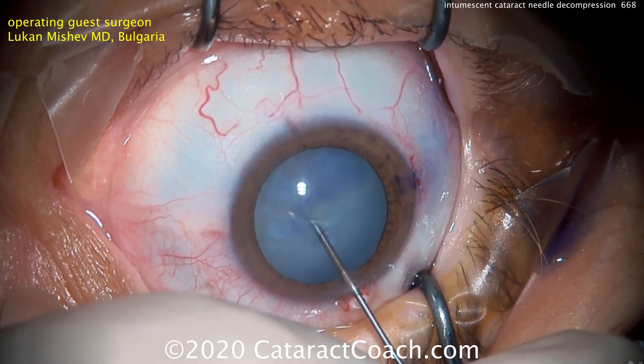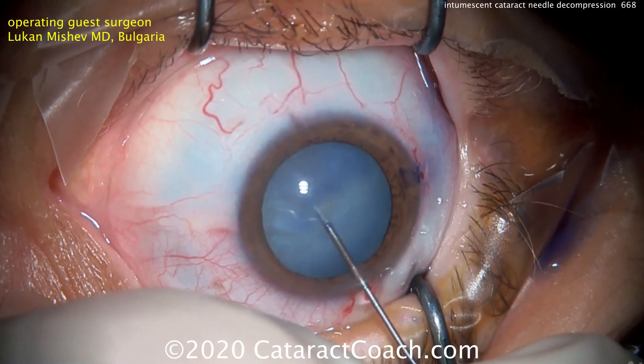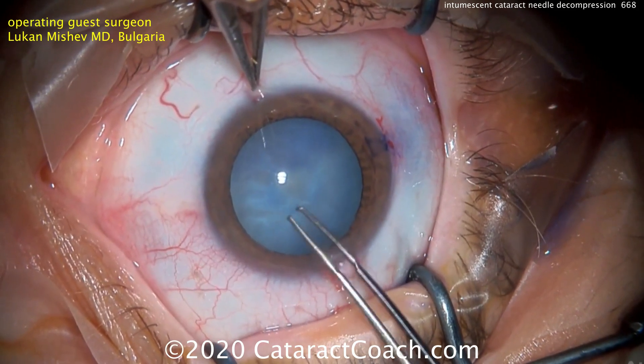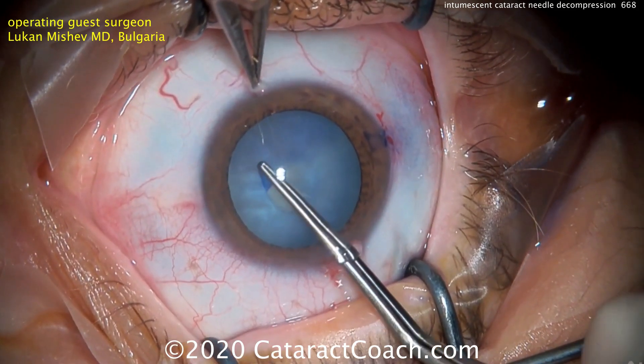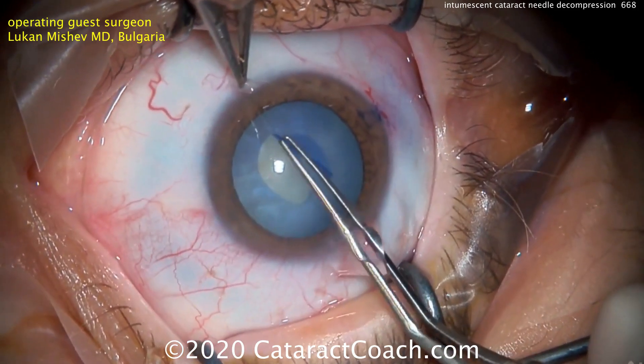Placing a 27-gauge needle on a 3cc syringe, we puncture the anterior lens capsule, being careful not to go too deep, and then we actively aspirate on the plunger. That helps remove the fluid from the capsule bag and decompresses it.